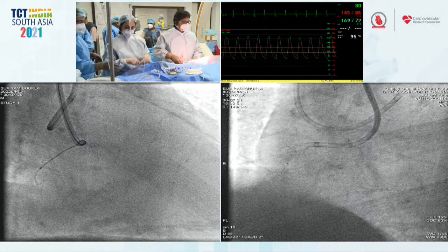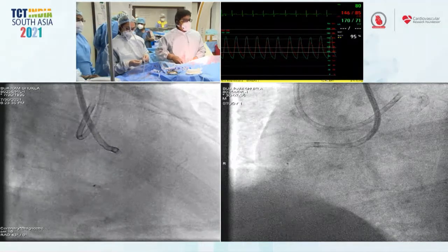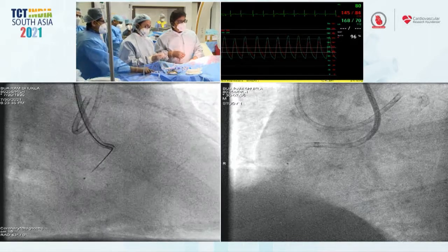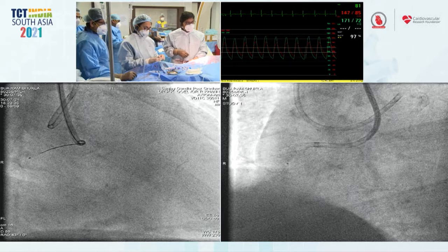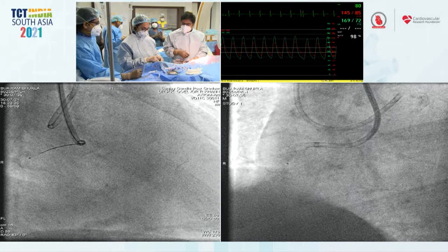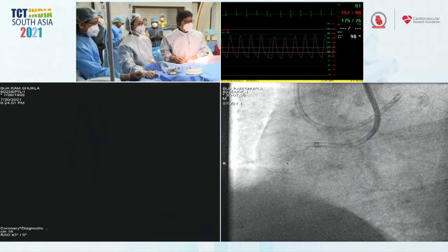So my experience in these, Kev, is that if you're really past the plaque and you're in a subintimal space where there's relatively little plaque, it's very, very hard to re-enter. I agree. So I'd probably back it up and start over. Do you agree with that? Absolutely. I think pulling this back and trying to find a new channel. And to be honest, this is where parallel wiring can be very helpful. Yeah, we can do that.